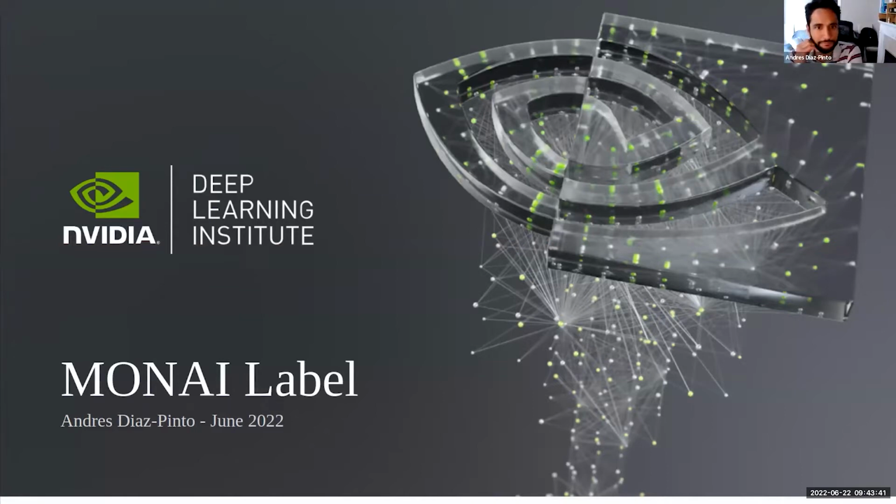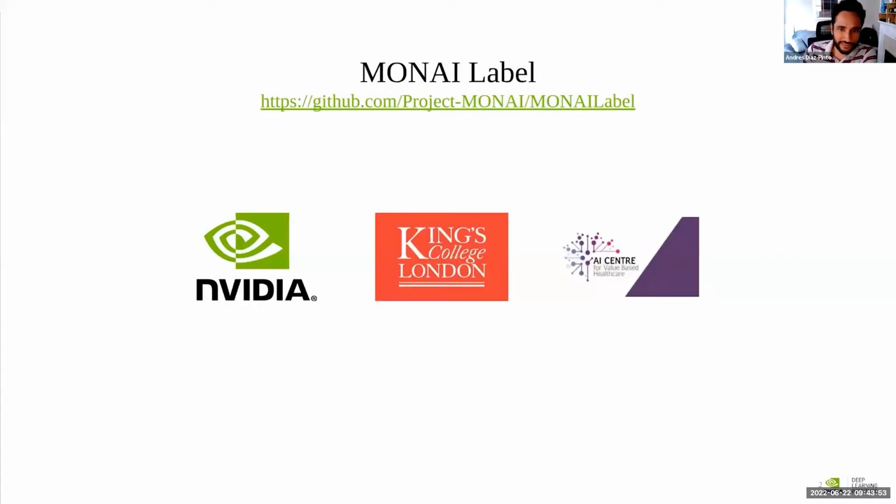Okay, so hello everyone. I'm Andres Diaz-Pinto. I'm also part of Nvidia. I'm a technical marketing engineer, and I hope we learn a lot from this workshop. So before I start talking about MONAI Label, I'd like to highlight that this project, the MONAI Label project, is part of a collaboration between Nvidia and the London AI Center, King's College London.